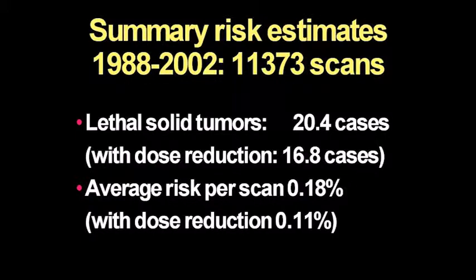If you input a certain amount of dose into this formula, and on the other end comes the result, you can say garbage in, garbage out. So if you have a model, this is just a model. It is not a presumption of what it really is.